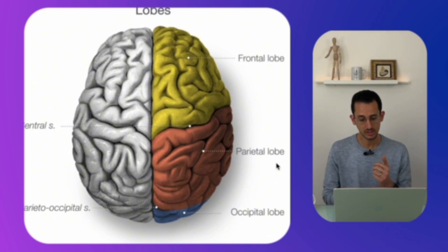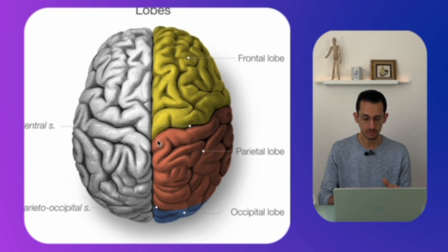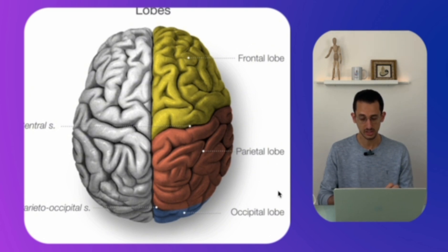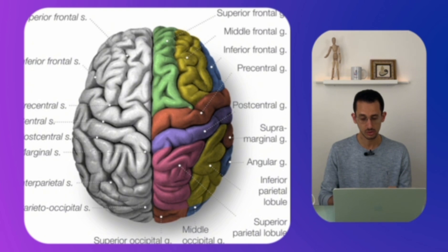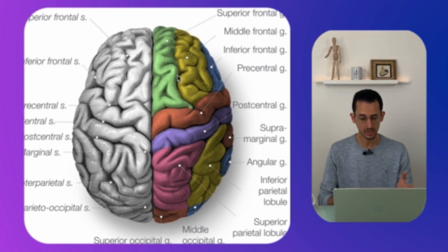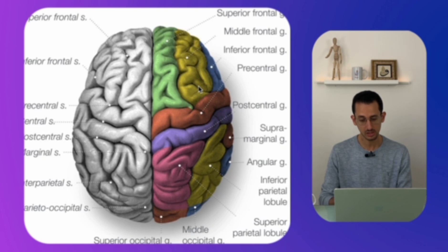Starting here — this is an image of the brain. You have the frontal lobe and the parietal lobe, which are separated by the central sulcus, and more posteriorly is the occipital lobe. We are subdividing each lobe into multiple gyri with sulci in between. In the frontal lobe, we have the superior frontal gyrus separated by the superior frontal sulcus, and then the inferior frontal sulcus separating the middle from the inferior frontal gyrus.